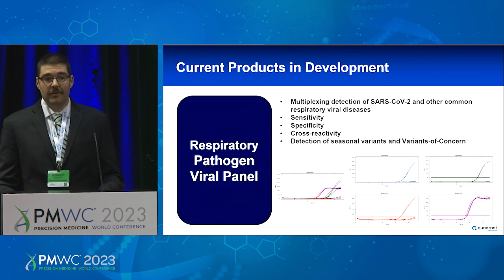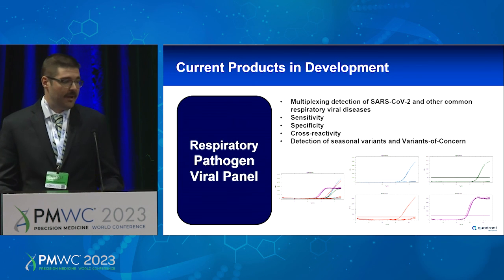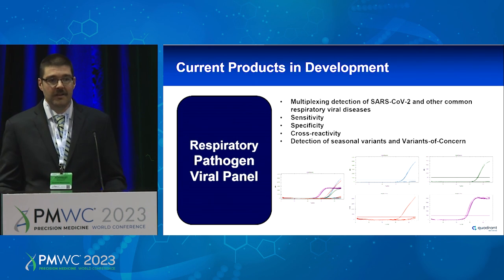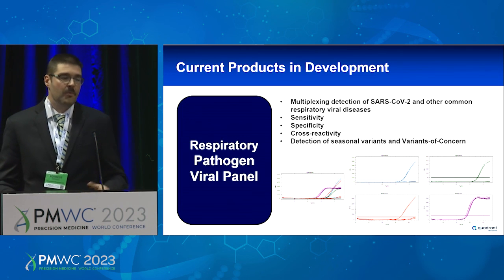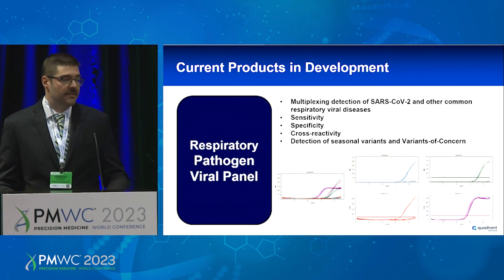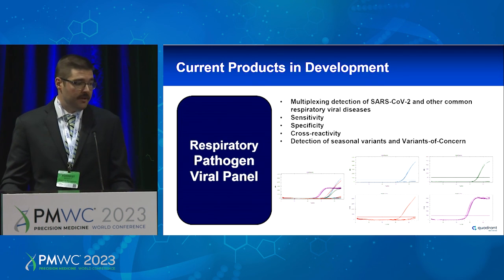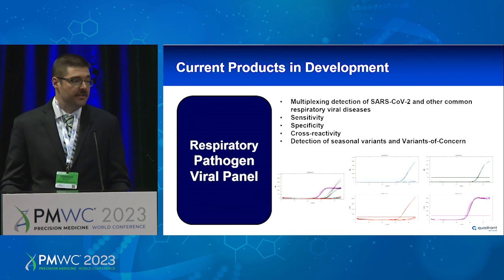For example, in viral infections, we don't necessarily have to do sequencing to diagnose that, right? So we've done extensive COVID testing in our region across New York State. You heard we were doing 10,000, or multiple tens of thousands of tests a day at the peak of the pandemic. Here we're doing the kinds of multiplexing development that many others are doing, but with our particular test combining COVID with other respiratory diseases.